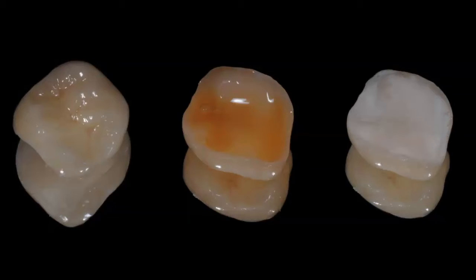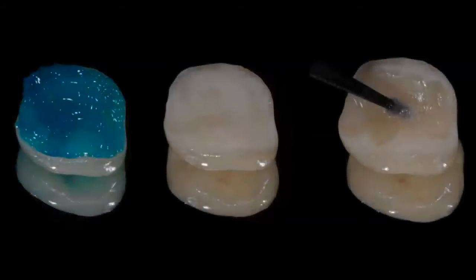Immediately after those 20 seconds, we rinse, and that's what you're seeing in my third photo on the right-hand side. What you're seeing is that white, frosty intaglio surface of the restoration, which is a consequence of the hydrofluoric acid etching. Much of that white layer on the intaglio surface is a white precipitant that we want to remove. We want to make sure we clean it off and leave a very nice, clean etched intaglio surface. So what do we do for that?